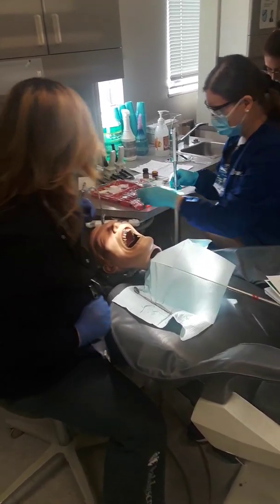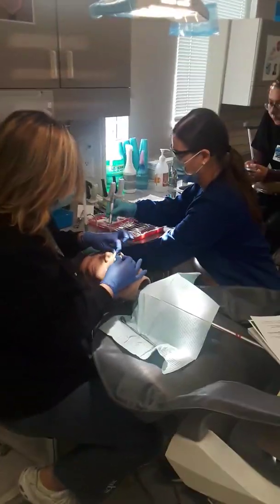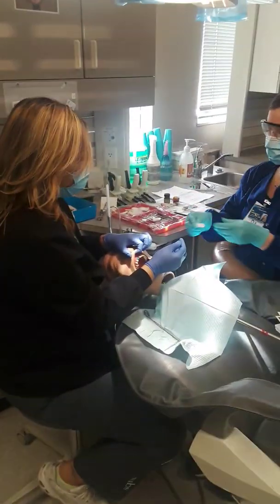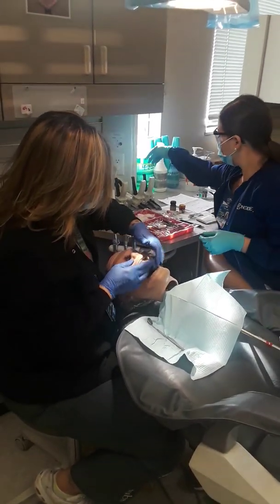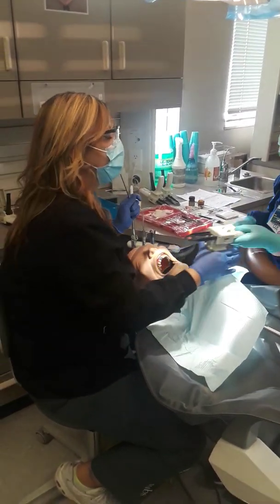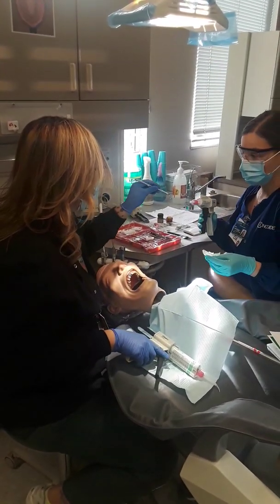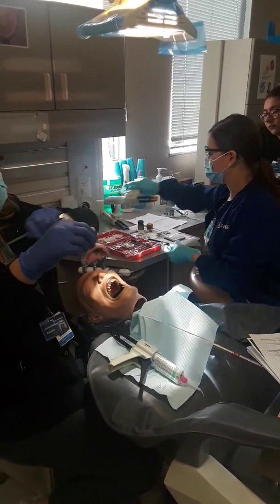Alright, so she completely dried my tooth. My tooth is dry. Let's change the cotton roll again. Isolated the tooth. Patient stay open, because now we're going to get ready to take an impression. Alright, so this goes around the tooth, and she's going to load the tray. So we're going to end up looking like this when we're done.